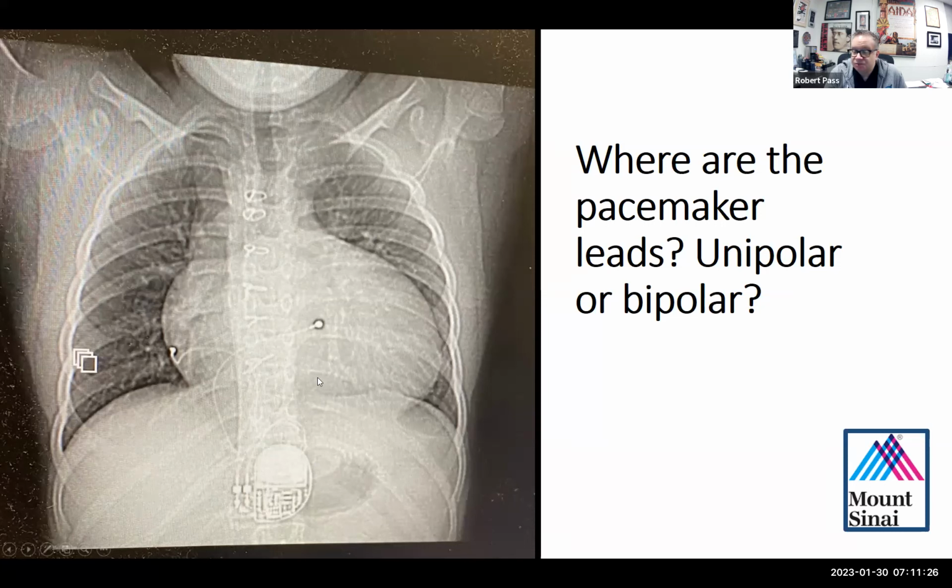And so sometimes non-cardiac electrical activity can be missensed by the device as cardiac activity, and it could cause inappropriate sensing and stopping of pacing. This is not usually as big a deal on the ventricular lead, but on the atrial lead, oftentimes there'll be a lot of far field ventricular electrical activity that can be seen on that lead, and sensing may occasionally be a problem. In general, these work very well.